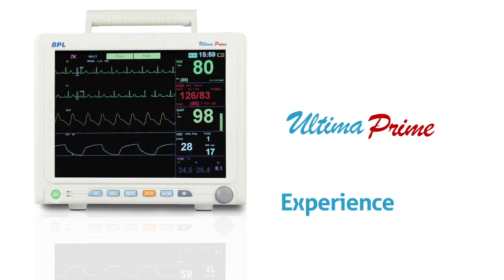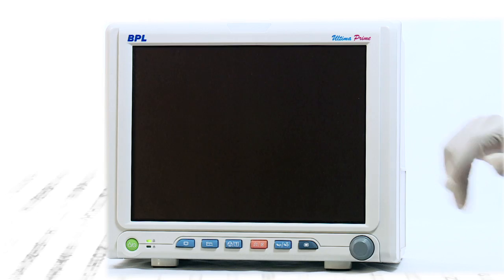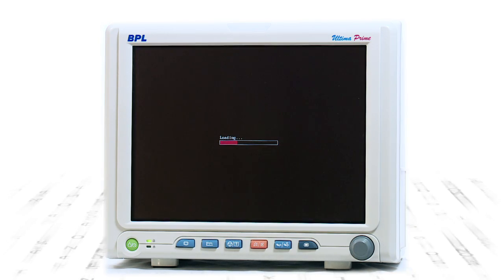Introducing BPL's Ultima Prime series of monitors that combine excellent performance with ergonomic design, providing efficient monitoring to patients in a wide range of scenarios.